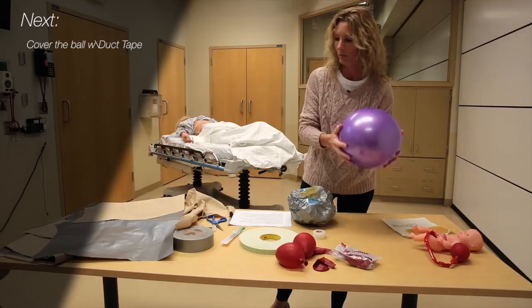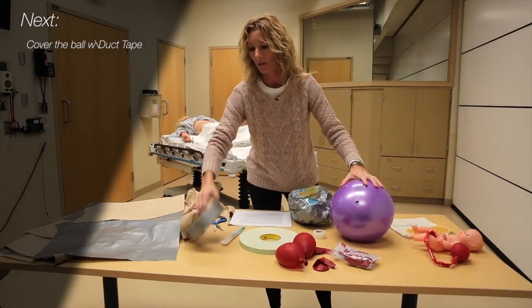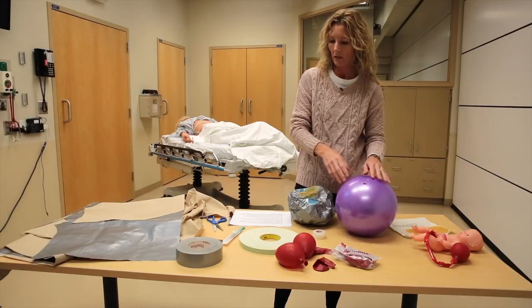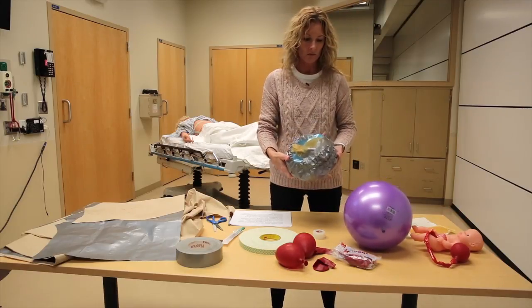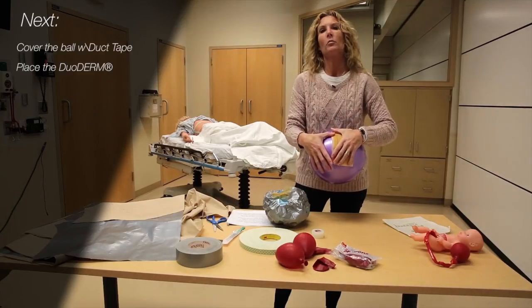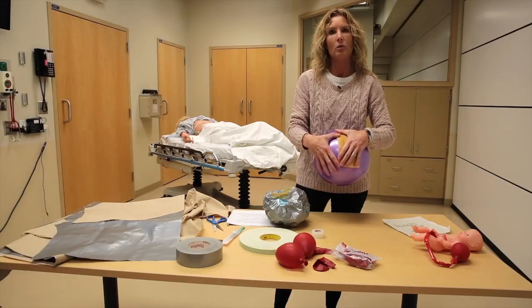Next, take your ball — the ball is the uterus — and cover it with duct tape. Covering the ball with duct tape helps prevent it from tearing once you cut into it to place the baby and the water balloons inside. This one has been covered with duct tape, and then you leave a small section open where you'll place your duoderm. That's just another piece on the outside of the uterus that gives the learner a more realistic feeling as they cut through the model to simulate an actual cesarean section.